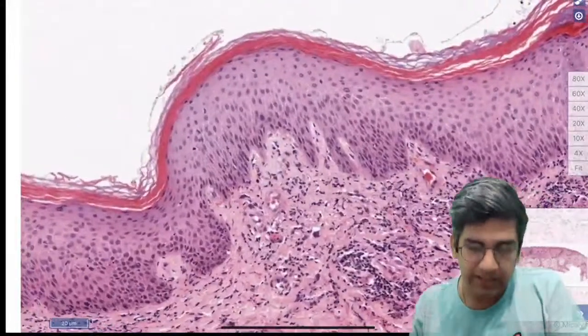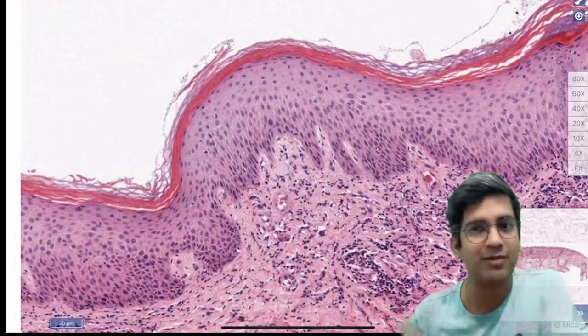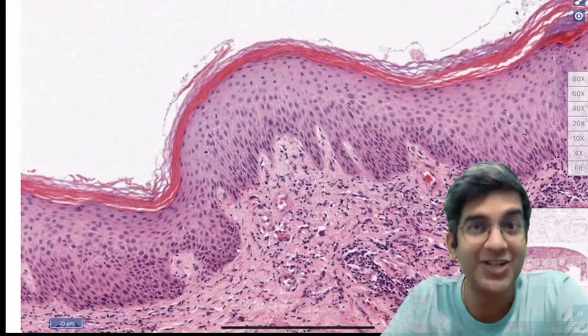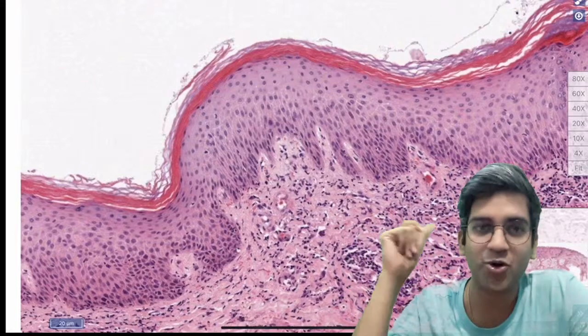So apart from that, come on guys, 20 of you online. I just want you to say epidermis is normal, abnormal. That's all. I am not even asking what abnormality. You guys are good enough. Okay, let's start one by one.